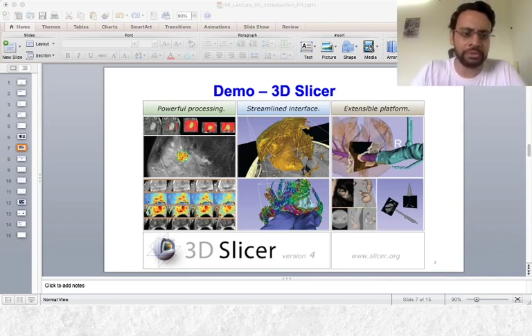FreeSurfer, again if you are doing something referred to as parcellation, particularly for MR imaging, this is widely used. An open source tool. You could do various tasks required for this purpose, like skull stripping, image registration, subcortical segmentations, surface reconstructions, tractography also people use it, functional MRI, this is used, and you have a visualization GUI as well for doing this. These are not the only tools, there are quite a few other tools also.